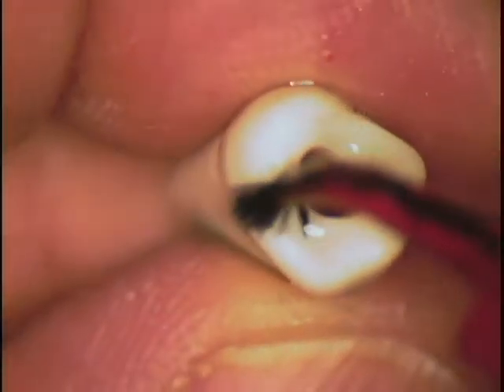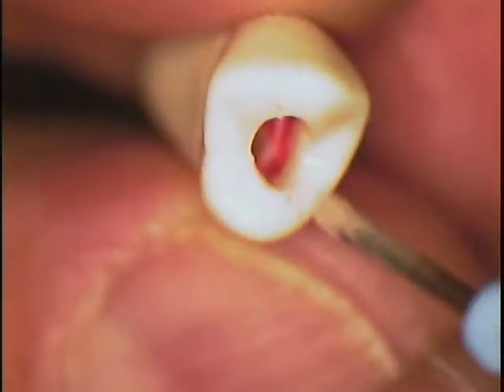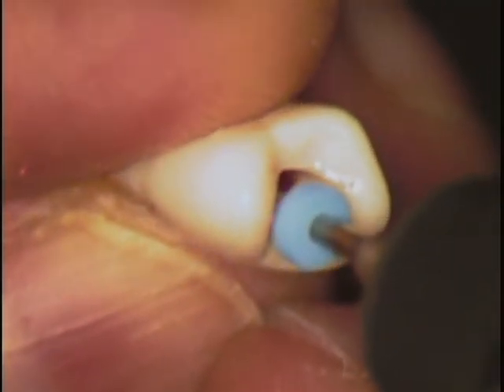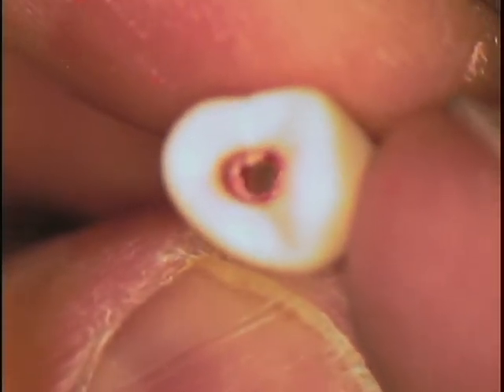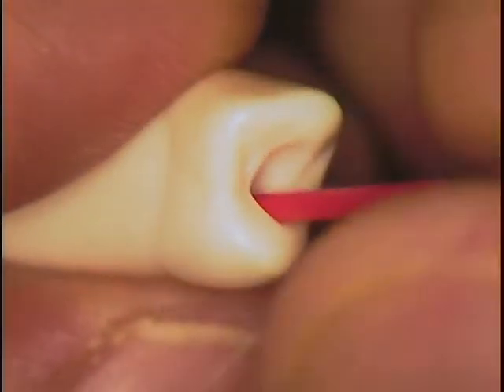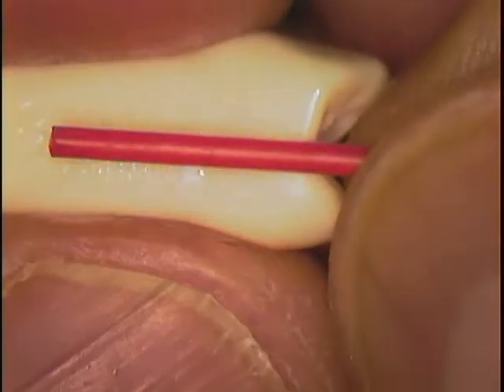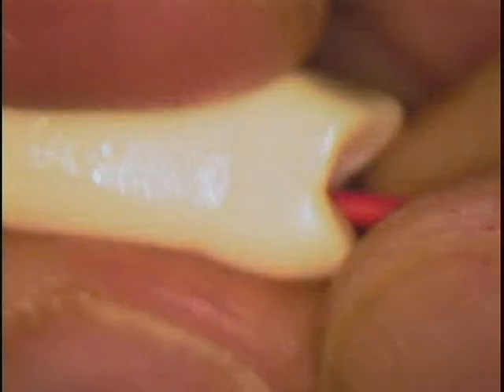And at this point, I could not check the patency because I don't have it filled, and there's debris going down into the end of that canal. But normally you would have it all sealed with gutta percha, which is the root canal sealing material. All right. So then we turn this off. Now you want to dry that thoroughly. I go ahead and get my post, insert it. That fits nice without any resistance, and if there's a little bit of resistance, you've got to go back in. So my post is right about there, 2/3 the length of the tooth.